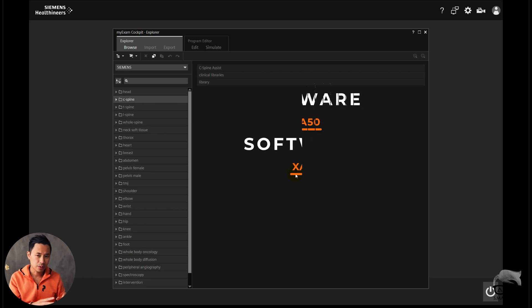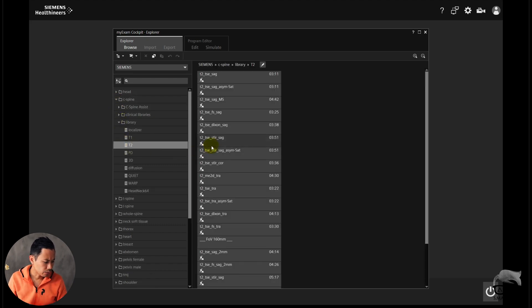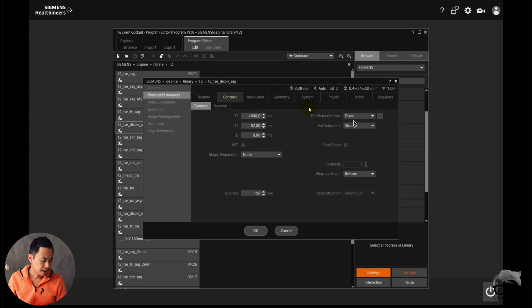We are at the XA50 with Deep Resolve available, but you also get Deep Resolve on XA30. Let's go to the exam card here. We go to Siemens and I'll show you the Dixon right here. We go to the C-spine, choose a simple one, take a T2 — you can see the Dixon right there. We open it in edit mode and open the sequence.